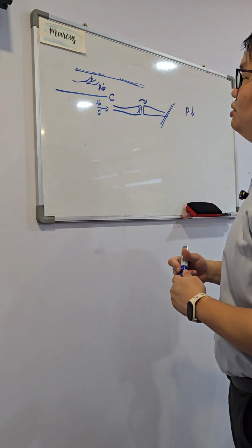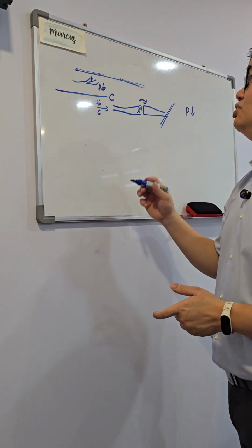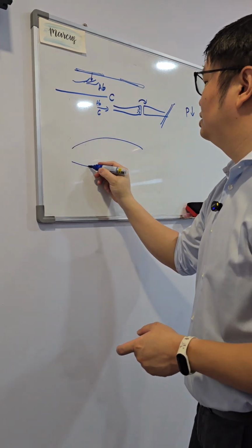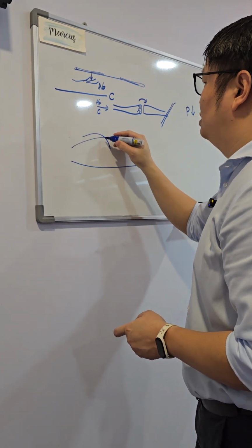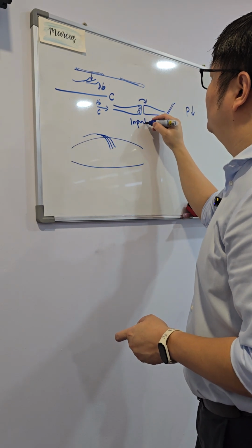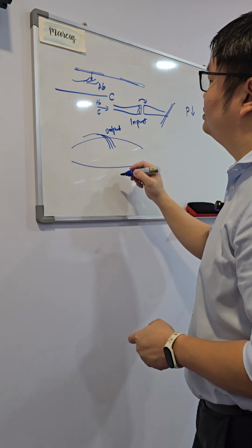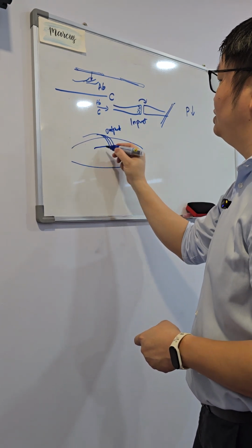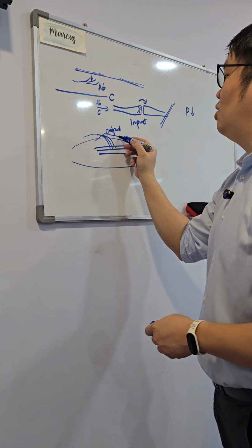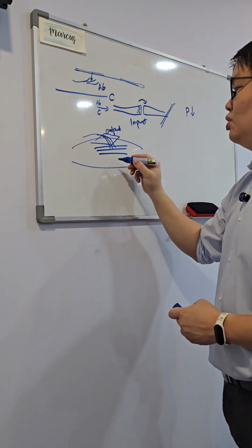Now, we are going to go for NMES. So what is NMES? We are now concentrating on output. So this is input and this is now the output nerves. The output nerves go into the muscle, and we usually choose to put the patch over the area of the highest concentration of motor points.